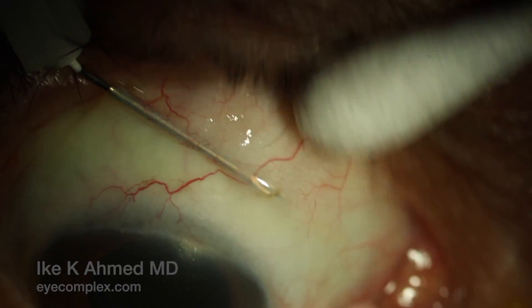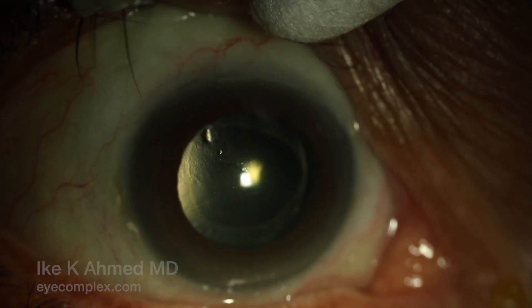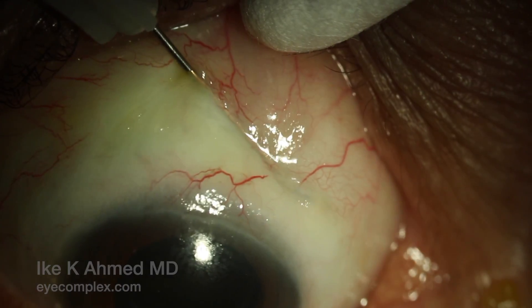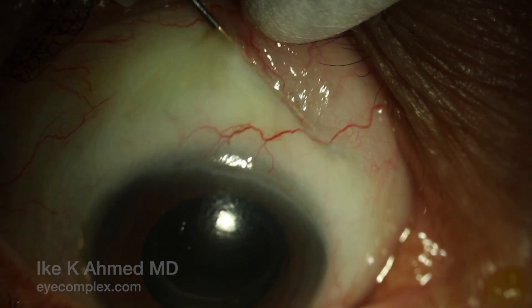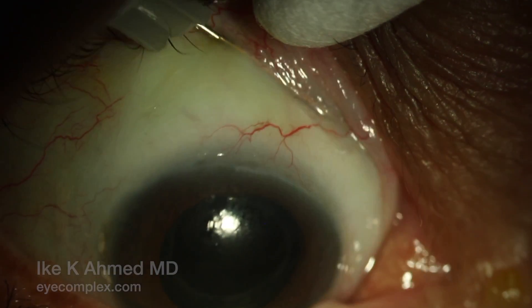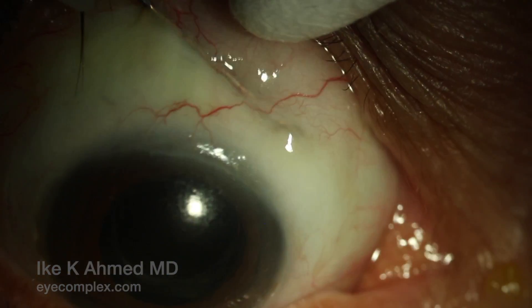There is the implant. You can see the needle bevel is under it, and now we sweep toward the fornix. This is a fairly vigorous maneuver to ensure that we have cut fibrotic tissue around the implant. This is done numerous times, sweeping widely, trying to get under the implant preferentially to ensure we release the typical fibrotic web or scar tissue overlying the implant.